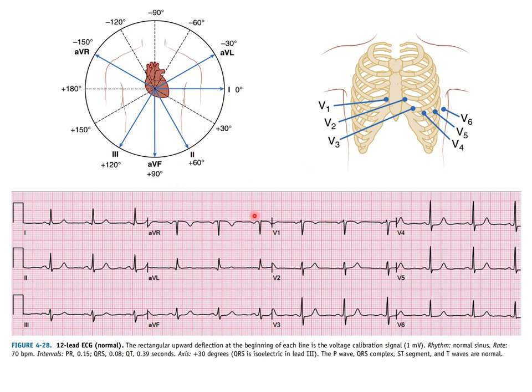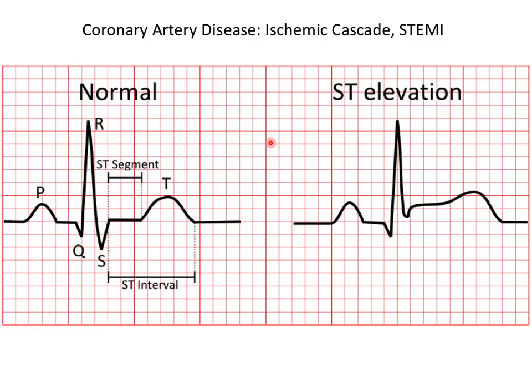Everybody who comes in and has chest pain gets an ECG, essentially. And what they're looking for on that ECG as a critical sign is a patch of the heart that is ischemic and isn't depolarizing correctly. The fundamental sign that that's happening is this section right here. Under normal conditions, a classic ECG looks like this.